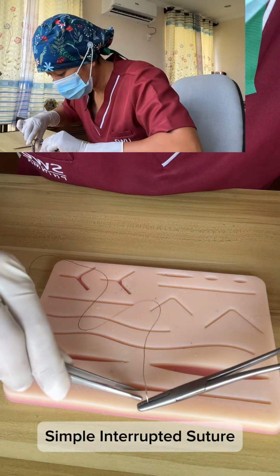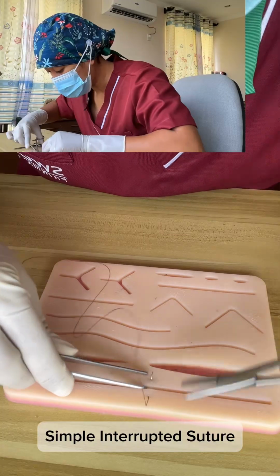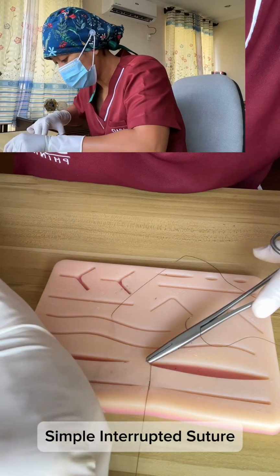First, I'm gonna start with simple interrupted suture. So from the name itself, it's interrupted. It is an appositional pattern because it brings wound edges directly together for best healing.